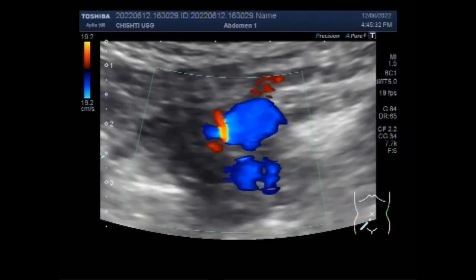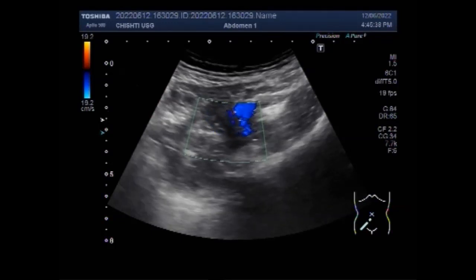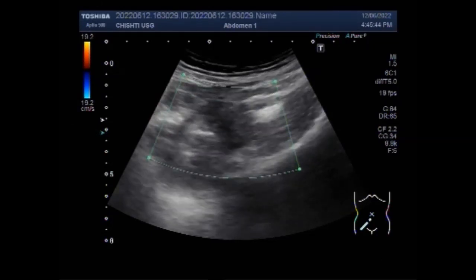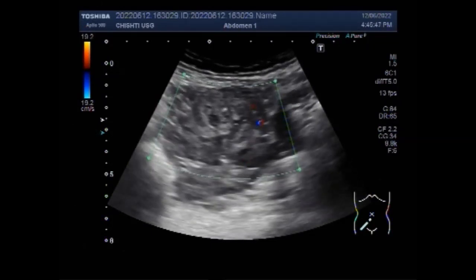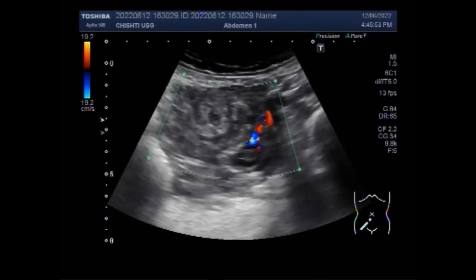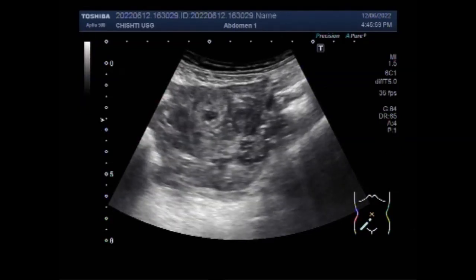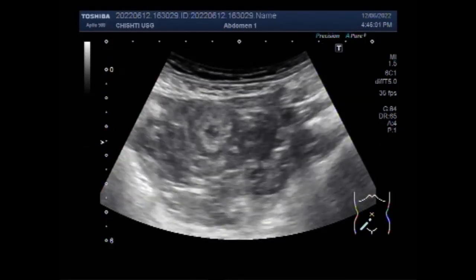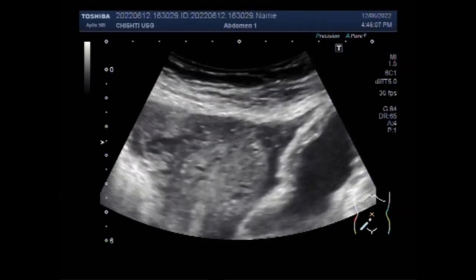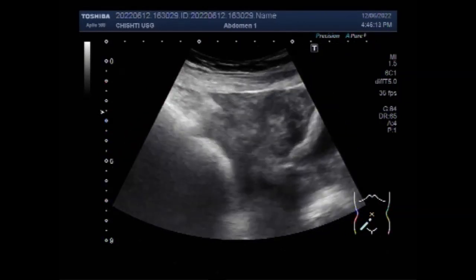One of the more common causes of changes in the endometrial thickness is pregnancy. Women who are having an ectopic pregnancy or who are less than 5 weeks pregnant may show signs of thickened endometrium. Absence of intrauterine gestation sac on abdominal ultrasound in conjunction with a BHCG level of greater than 6500 mIU/mL suggests the presence of an ectopic pregnancy.